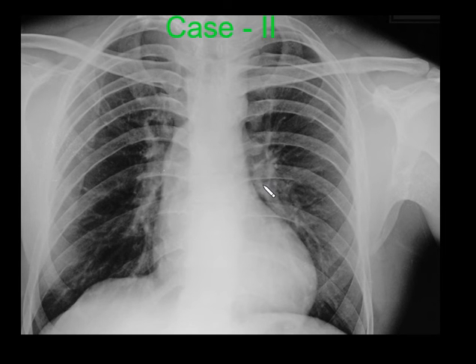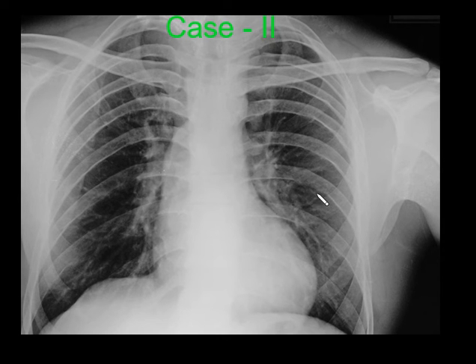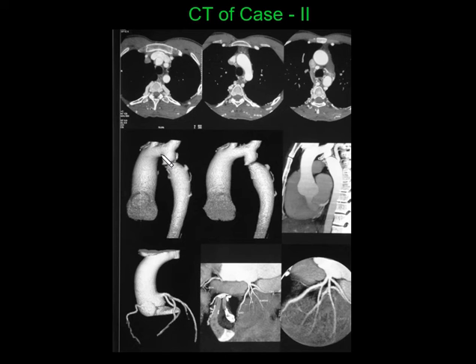A second case of coarctation of aorta shows dilated ascending aorta and arch of aorta with the descending aorta not seen and inferior rib notching. The CT of that case shows the post-ductal stenotic segment with the ascending aorta, arch of aorta, and descending aorta with a constricted segment.